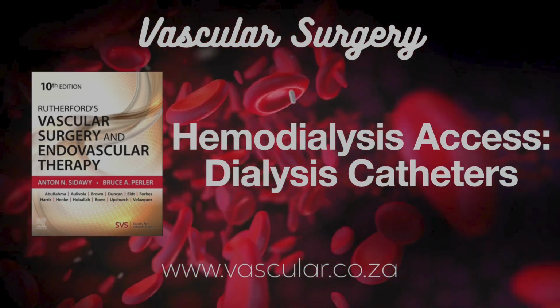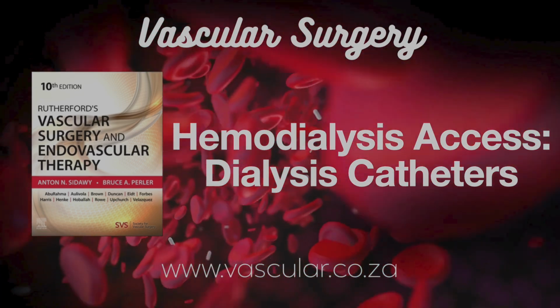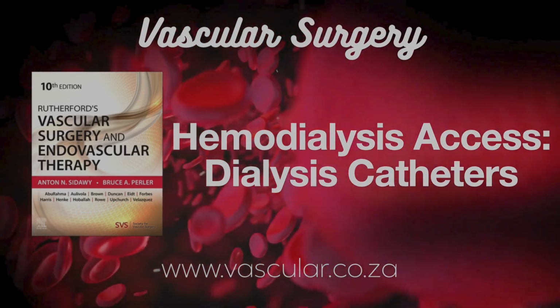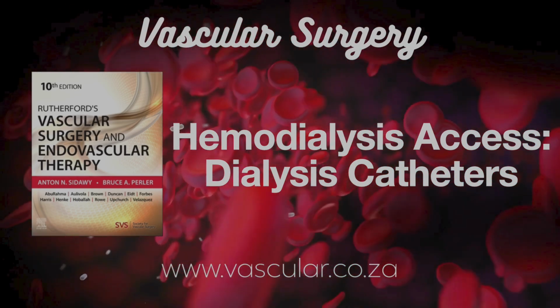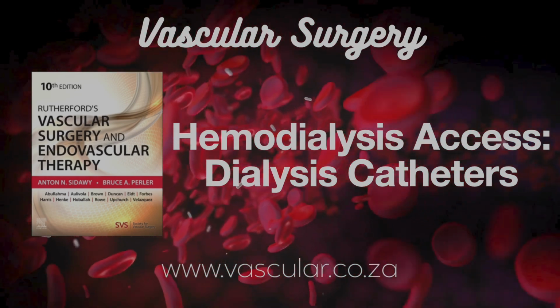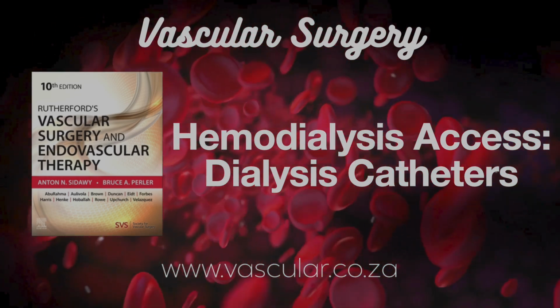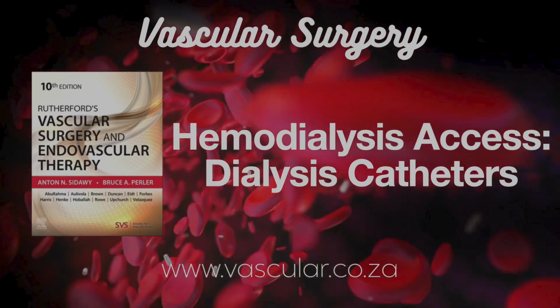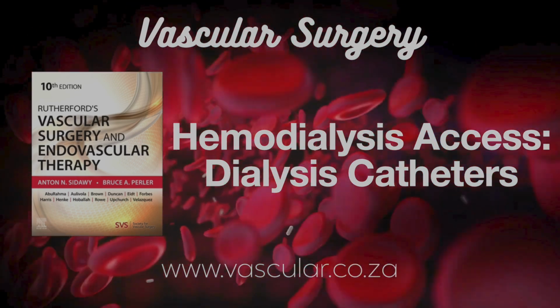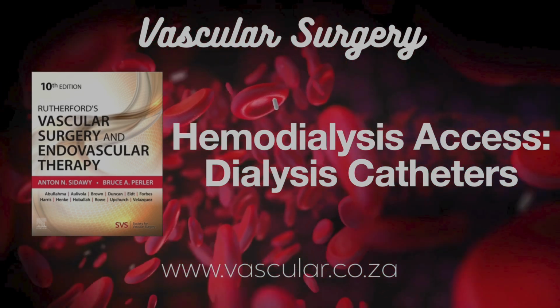Crucial. Teach them to immediately clamp or cover any open catheter end and get help. We put occlusive dressings on after removal, too. If someone collapses suddenly, suspect air embolism. What's the immediate management for air embolism? Clamp the catheter. Position the patient head down, left side down. The Durant maneuver tries to trap air away from the lung artery outflow. Sometimes you can even try to aspirate the air with the catheter.